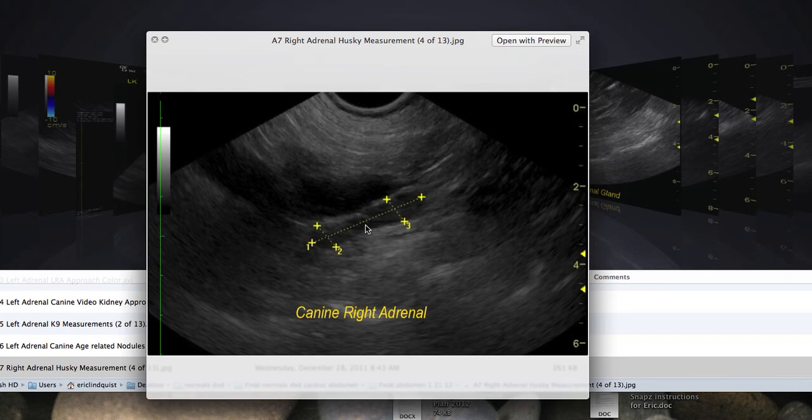Moving to the right adrenal gland — depending on the breed, the right adrenal tends to be longer and have a wider base. We're not catching the full base here, but we can see the phrenic vein going into the vena cava. We have the tip, the length, and the measurements of the cranial and caudal poles. This was a husky — a longer dog with a longer adrenal gland, a normal conformation. A greyhound or pit bull tends to have a less wide base than other dogs.